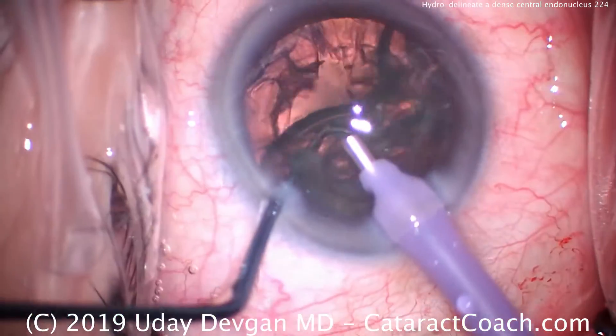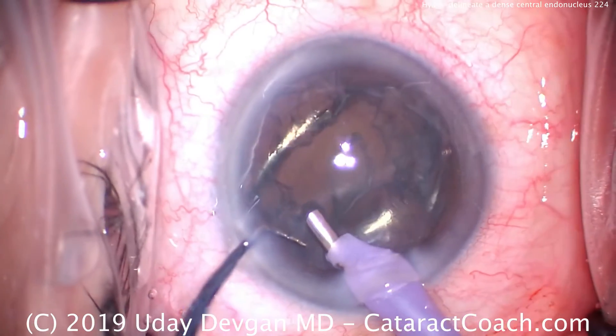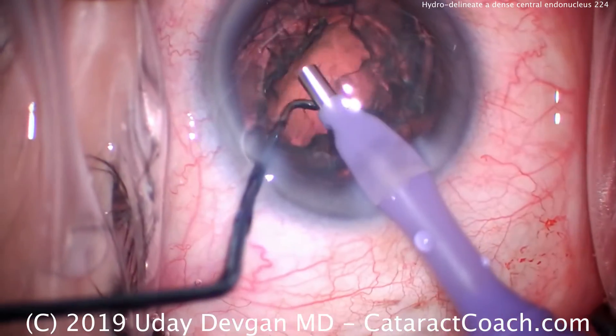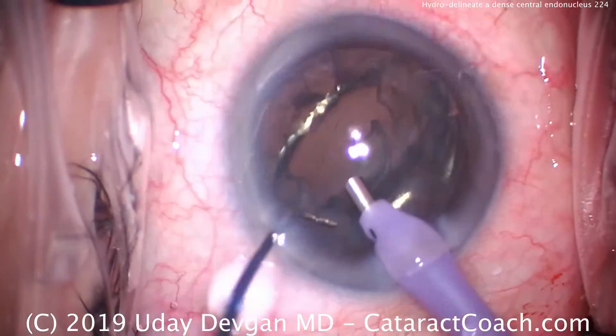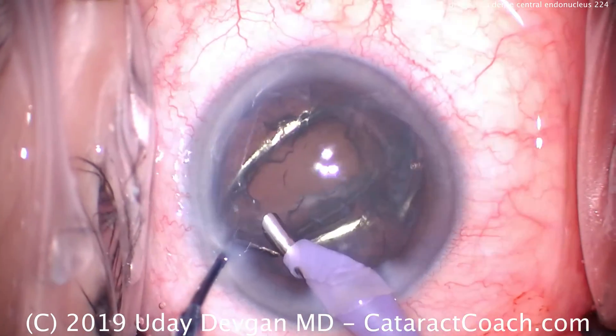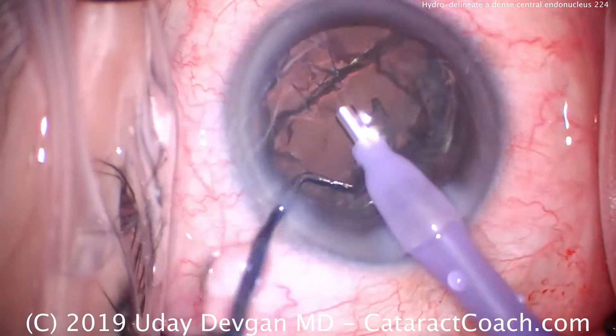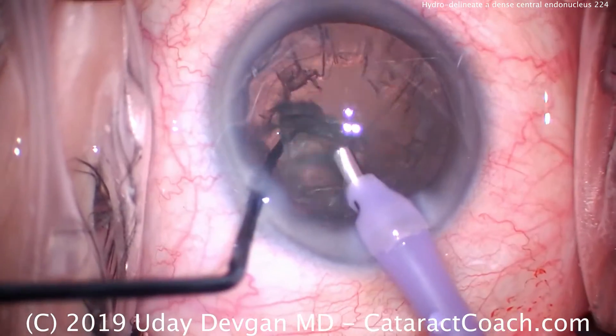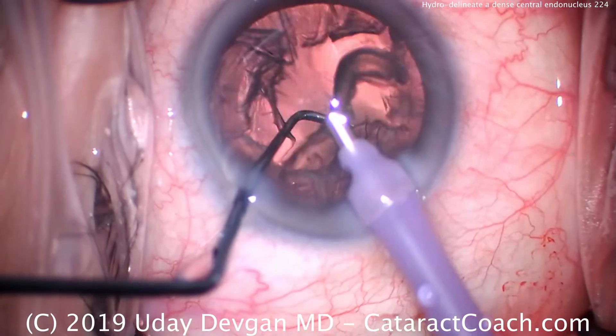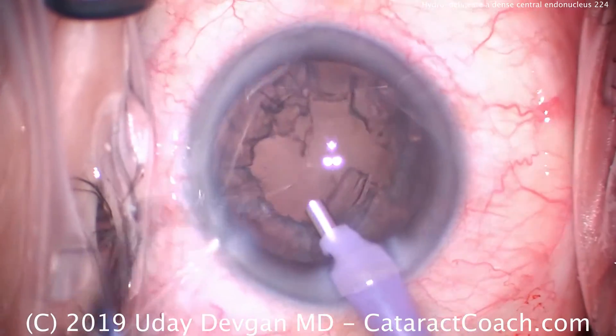The epinuclear shell is removed using just vacuum — we bring it up, flip it over, and taking our time, we remove the whole epinuclear shell with the phaco probe. At this point we're not using any energy; there's no ultrasound. We're only in position two, aspirating through the larger bore of the phaco tip. Chopper in protective mode, and let's go to the end of the case.